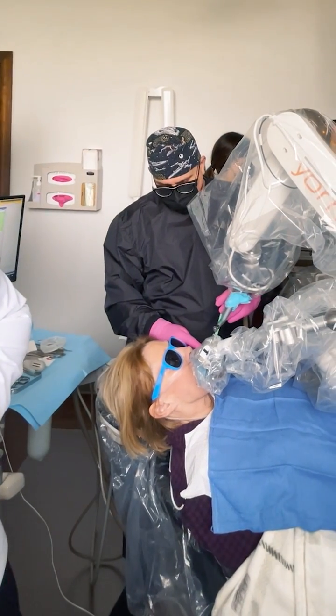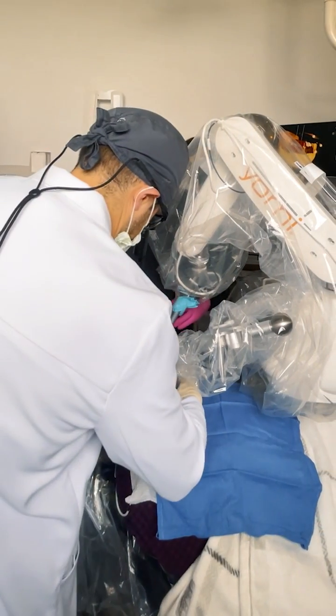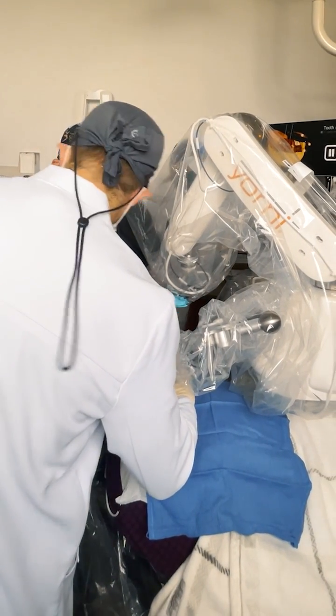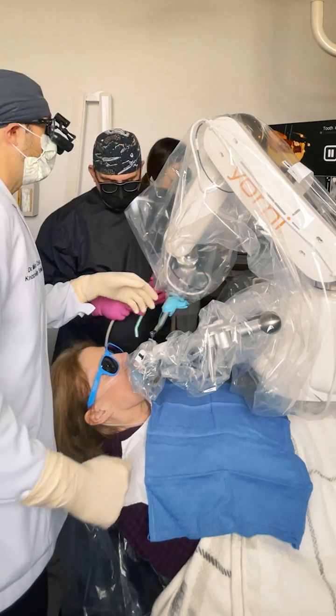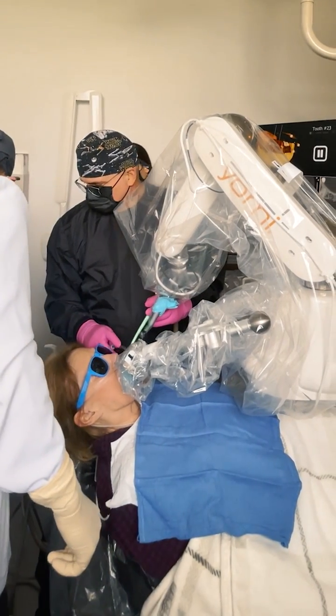I'm going to go ahead and just change the type of drill that we use, just so we can puncture that bone, where she's been edentulous for a while. And we're going to do one after the other, since they're both areas that are edentulous.